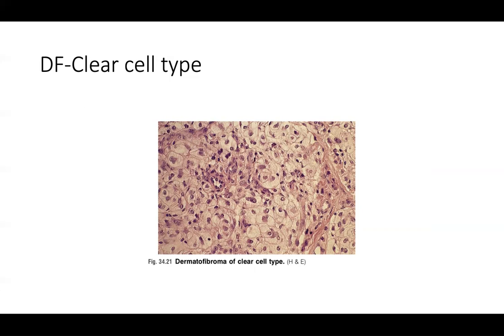You can have distinct dermal tumors that are mostly clear cells. Anytime you have clear cells, it's going to bring up a wide differential. But if you rule out melanoma with SOX10 or Melan-A staining, and you rule out renal cell carcinoma with PAX8 staining, and you're just left with clear cells of unclear origin, then you could think along the lines of a dermatofibroma in your differential.